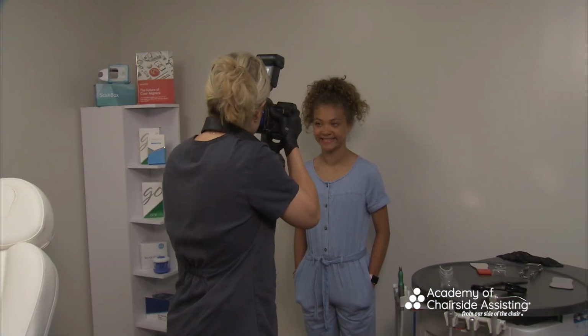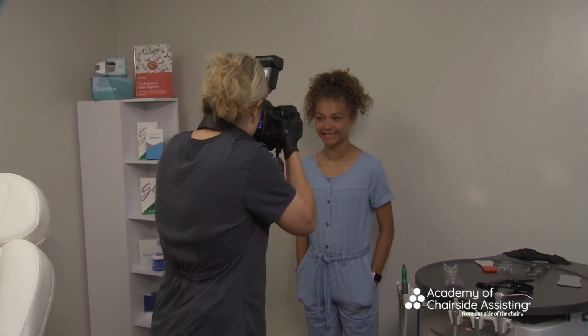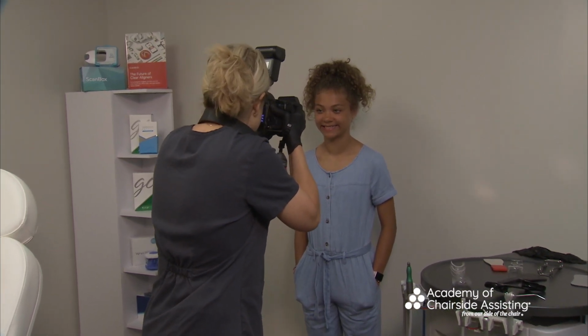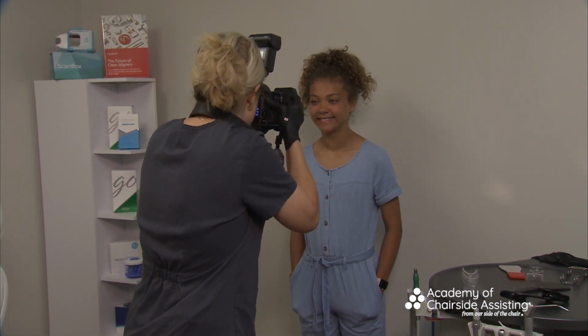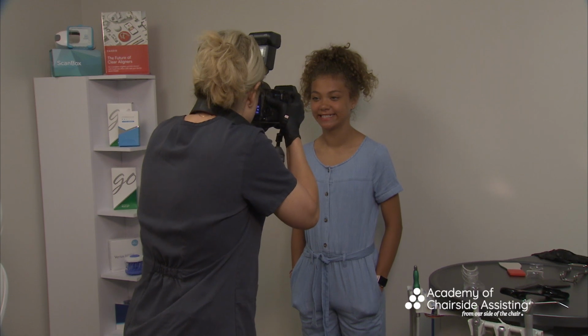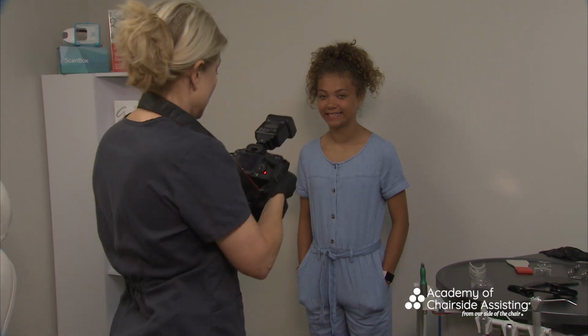And I'm going to turn, remember you talked about the ring flash, you see how that was turned? Don't hold it underneath. Hold it in a C position. Chin up just a little bit. There you go. Hear the beep? Much better. And you may say, well, Shannon, it's not a big difference, but I feel like I'm dead in the center and I really don't have as much of her face.